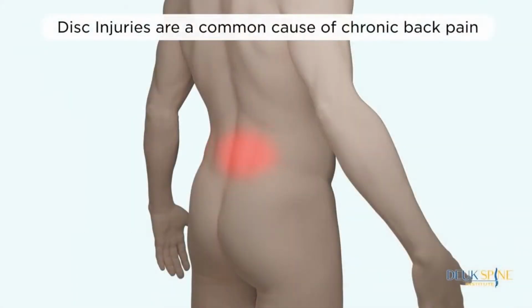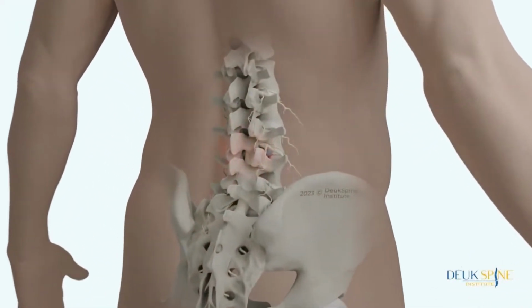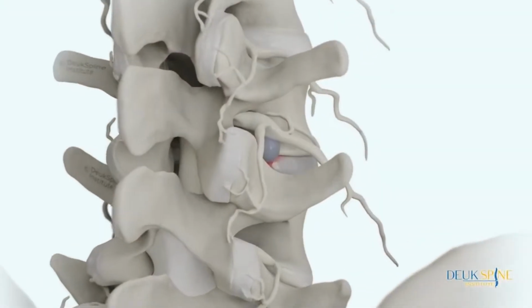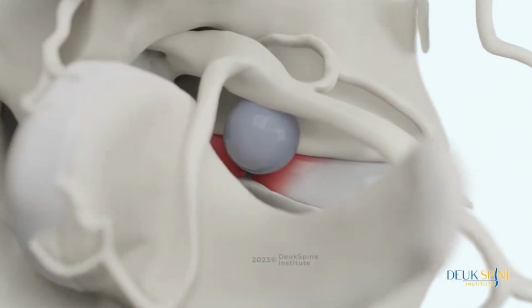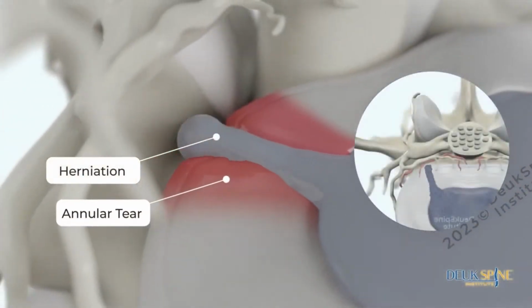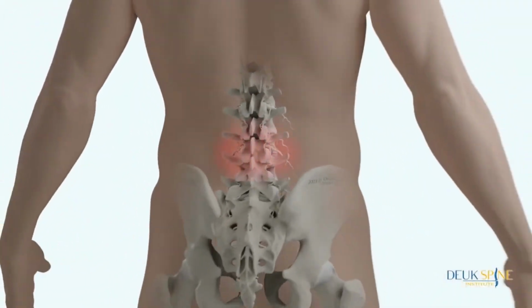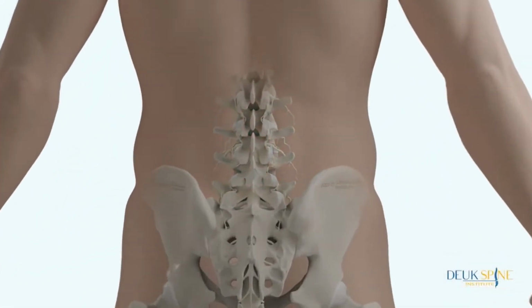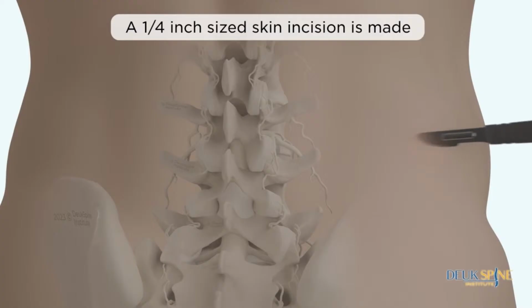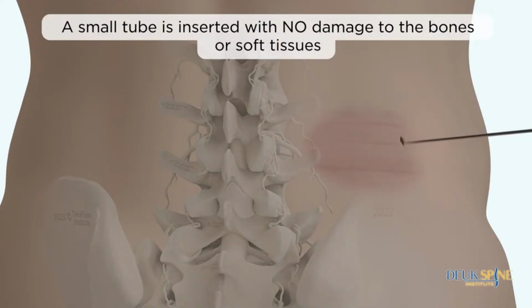Disc injuries are a common cause of chronic back pain. The inflamed annular tear causes back pain. A 1/4-inch sized skin incision is made. A small tube is inserted with no damage to the bones or soft tissues.